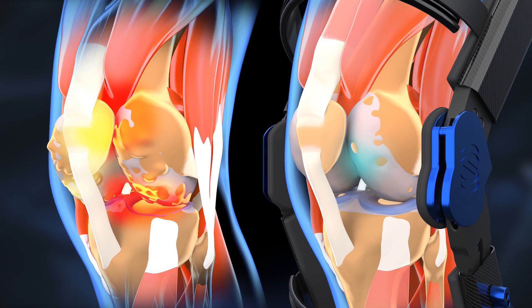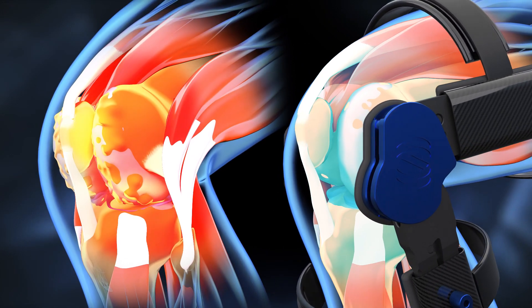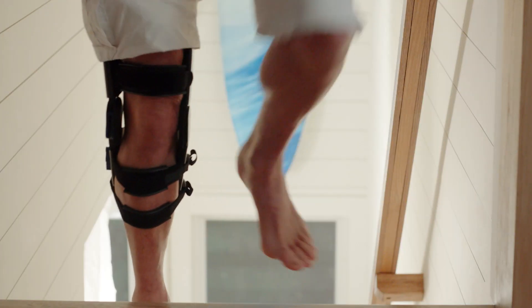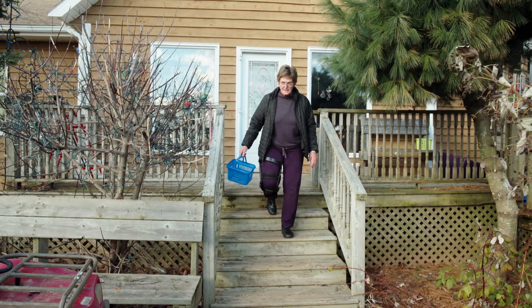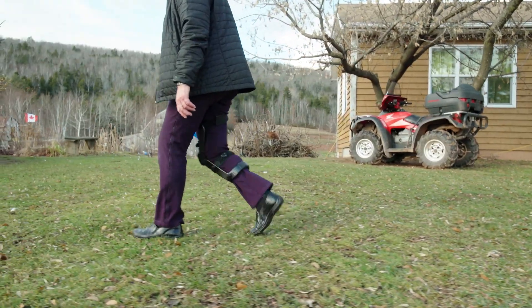This reduction in pressure across all three compartments of your knee can rapidly reduce or eliminate pain, allowing you to get back on your feet and do more of what you love. As your mobility increases, your muscles can strengthen and the assistance provided by the brace can be dialed back or turned off altogether.